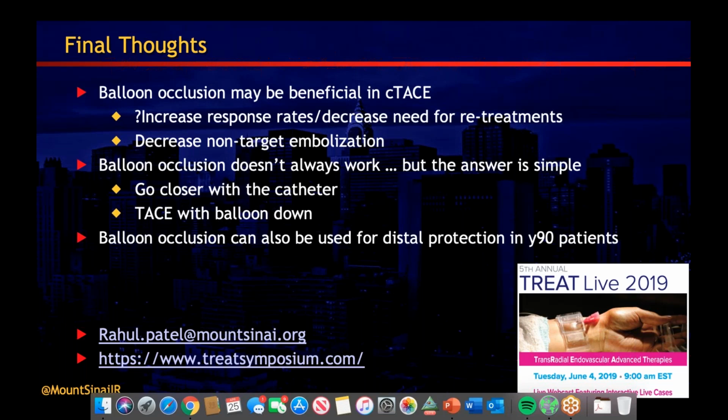Yeah, so typically no, because even with the balloon catheter, we're trying to get as close as possible. So we're basically taking down the target segmental or subsegmental artery. So we typically don't see occluded vessels. But in the one example I did show, we ended up TACing proximal, and then that distal vessel still remains patent because it was sort of retrograde filled while we were embolizing it.